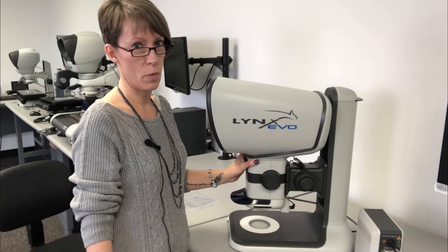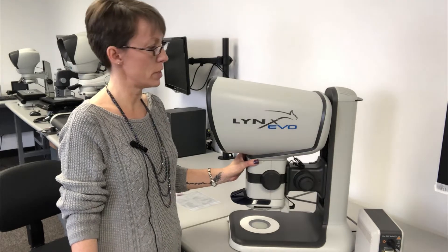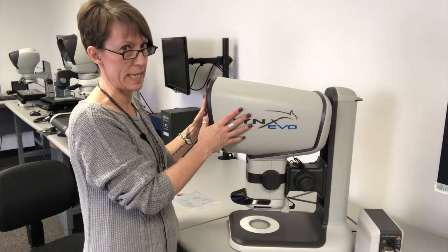Hi, I'm Jennifer Genalfi, one of the senior service technicians here at Vision Engineering, and I'm going to show you today how to replace the desiccant in your Lynx Evo head.